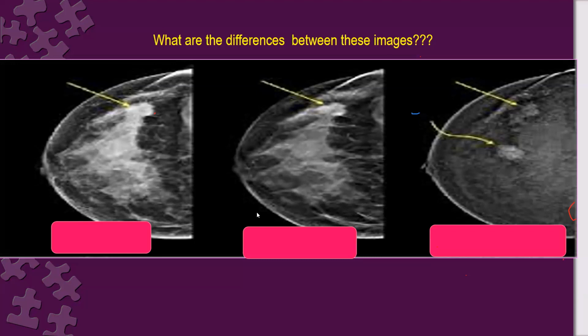And the image in the middle, the lesion is not clear, but the resolution is more than the first image. Yes. So look, digital here also. Look for the more details. The second, the middle image, is digital.